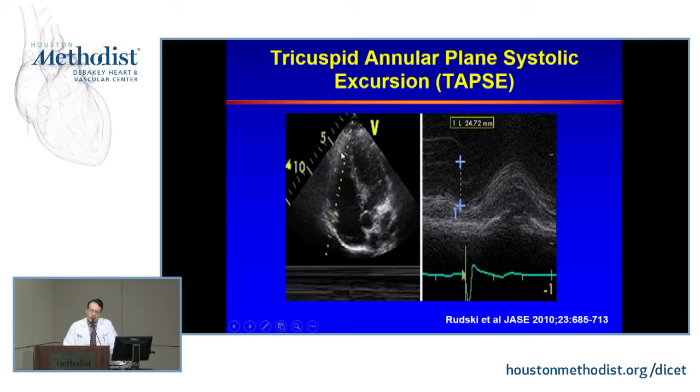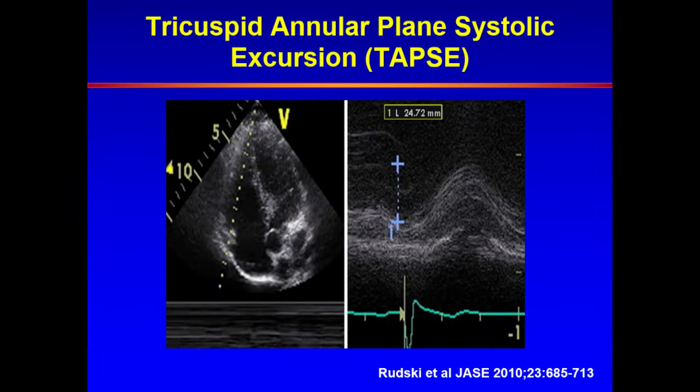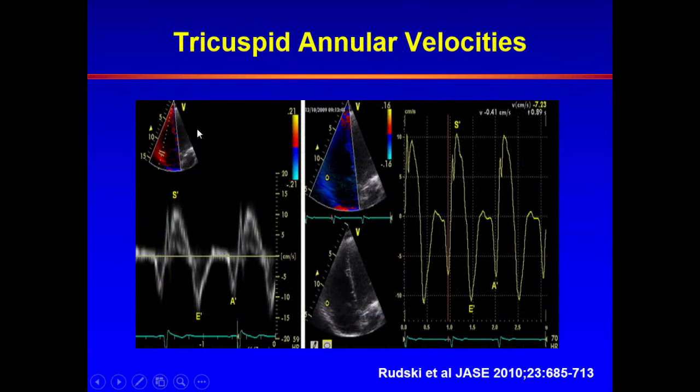Turns out the motion here is not necessarily equal to contractility because there is also another motion that happens for the whole heart, which is rotation. And depending on the direction of rotation, you may have cases where there is true RV systolic dysfunction but an apparently normal TAPSE.